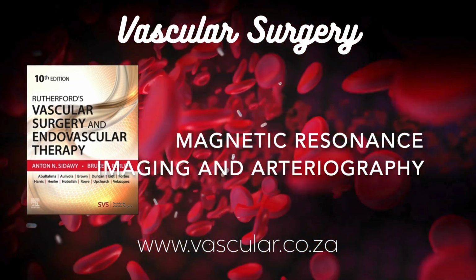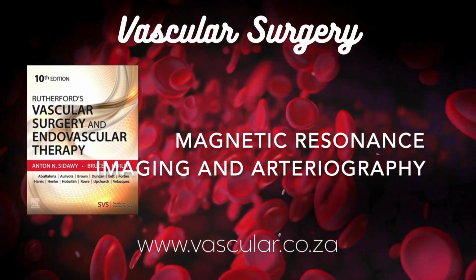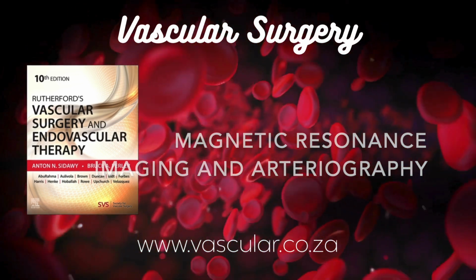And the holy grail, plaque imaging. Can MRA see inside the vessel wall itself? Yes, this is another major strength of MRI. Its excellent soft tissue contrast allows it to potentially distinguish different components within an atherosclerotic plaque.